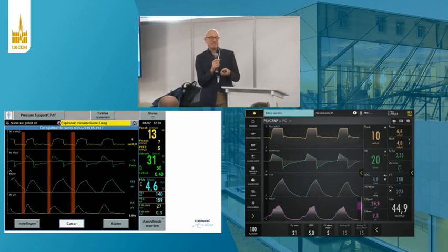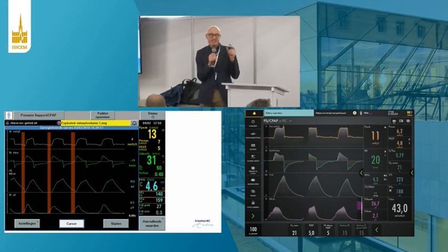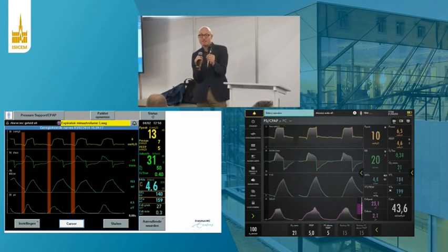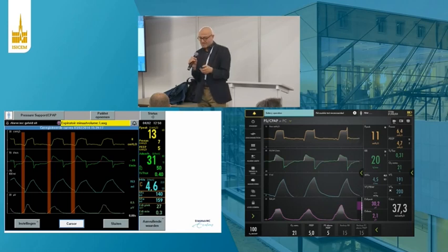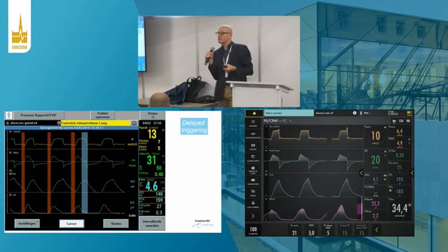So the first thing we have right here is inspiratory delay, right? The inspiration of the patient starts at the beginning of the red box, but the ventilator cycles on at the end of the red box. So there is a delay. Is this clear for everyone? And secondly, as you already correctly identified, there's a cycle off delay.